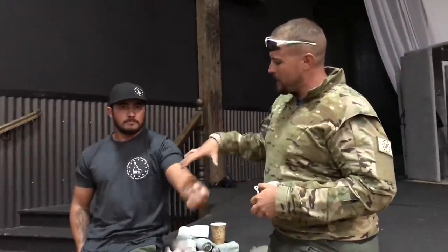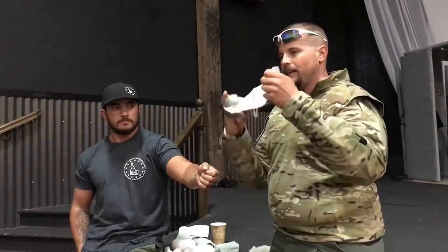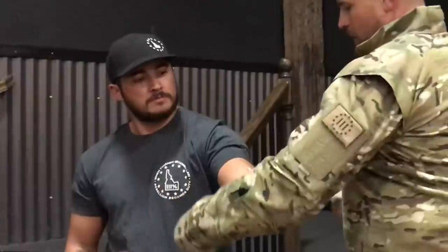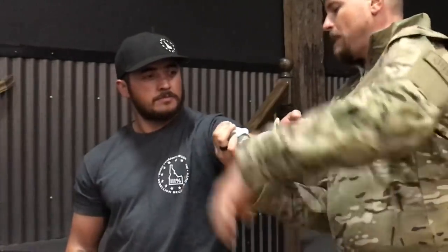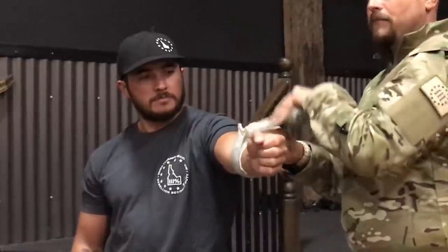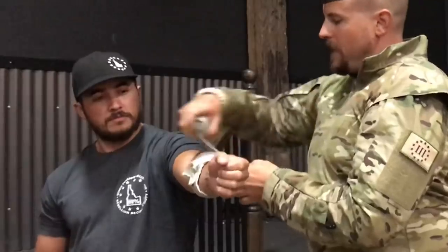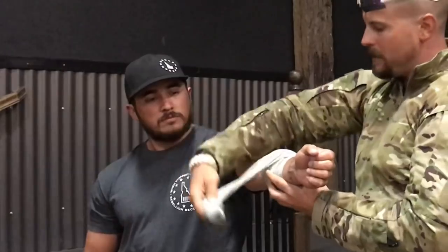Depending on the severity of the injury, we can get some sterile 4x4s, put that on the injury first, then wrap with the Israeli. Today we're just going to wrap with the Israeli. It's going to have a white side — keep that sterile, don't get your fingers all over it. That's going to go on the injury. I'm going to wrap that little tail up underneath and start wrapping back on top of itself. My preferred method is to go on both sides of those little ears, get it fully underneath, and then wrap back on top of itself. From there, we're going to wrap away — I'm going to go high, I'm going to go low. If I feel like I need to create more pressure, I can put a twist inside that bandage right over the top of the injury.